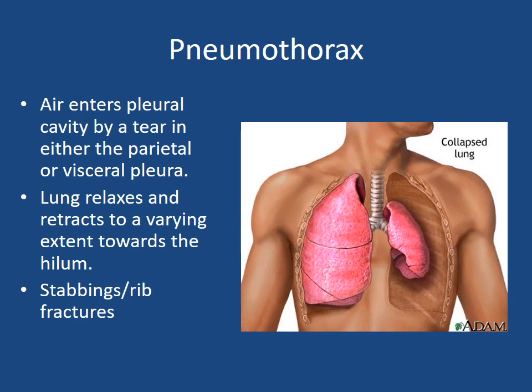We're now going to go on to consider a pathology called pneumothorax. The term pneumothorax means air in the pleural cavity. This can happen by either a tear in what's called the parietal or the visceral pleura. The pleura are the coverings of the lungs, and these help the lungs to stick to the outside of the chest cavity.